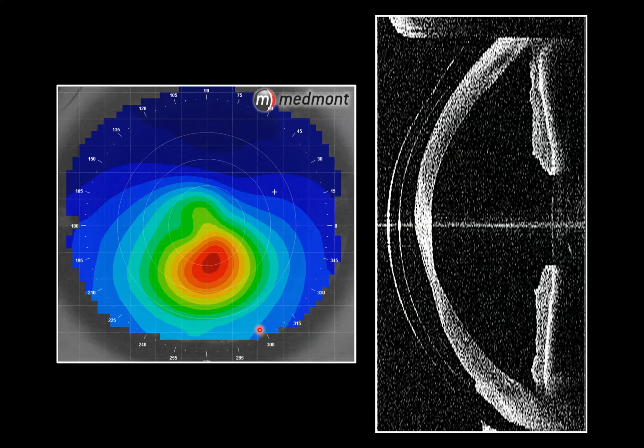So when we place a scleral lens on eye, like the SmartLens, what we're doing is providing a new anterior surface. So regardless of the irregularity underneath that lens, that front surface of the rigid lens is going to provide a much better medium to bend light properly to the fovea, creating better quality of vision.